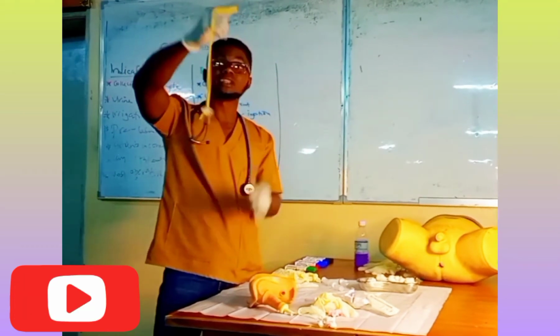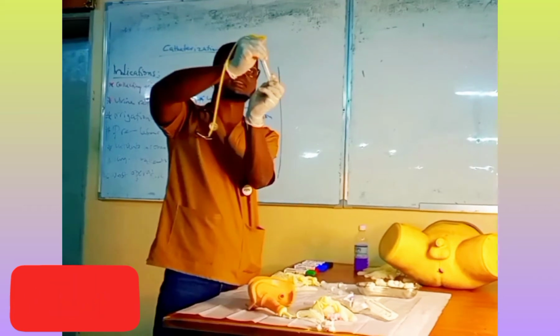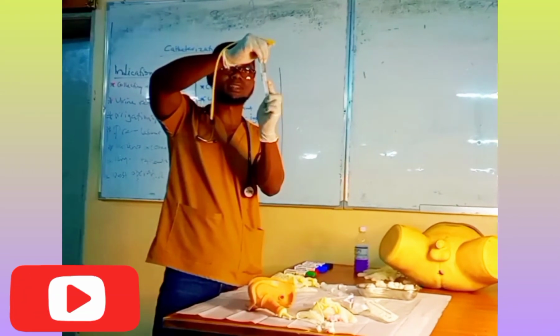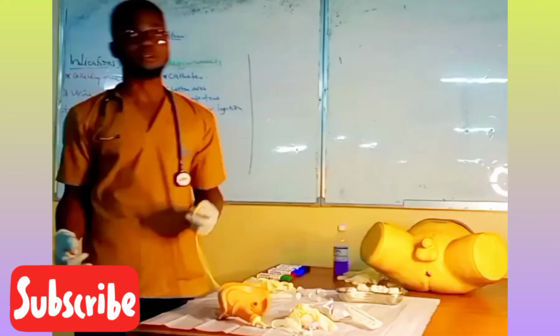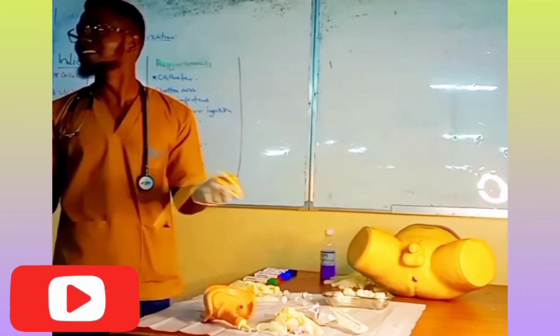Remember, I put 20 milliliters. Then I need to bring another one also. So are you seeing what is happening to the balloon? It has collapsed. So from the patient, its function is done.